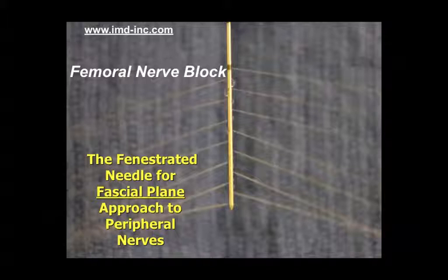We'd like to take a few moments to show you an instructional video on the use of a new fenestrated needle for fascial plane approach to peripheral nerves. We would like to specifically deal with the femoral nerve block in this video.